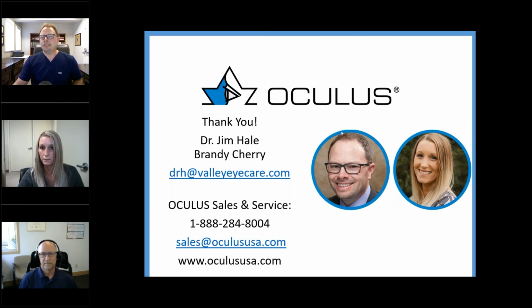Right. Yeah, another thing is that the technicians really need to be trained to jump to action when an on-demand visual field test is ordered. So this is just training, and hopefully with some enthusiasm, your technicians would take right to it. When the on-demand perimetry is ordered, they need to get the machine up and running. They need to plan how to continue the clinic flow with the patients that are there, avoiding delays. And they also need to be there to help facilitate the doctor staying on schedule.